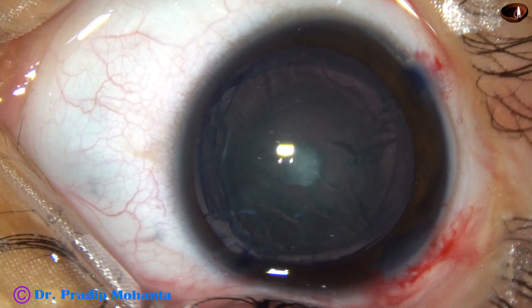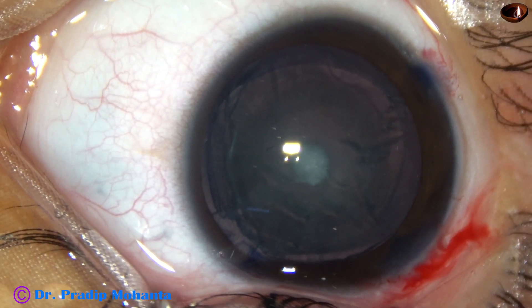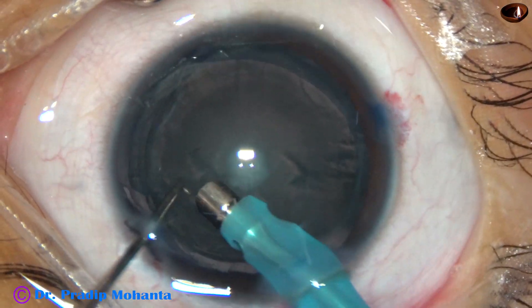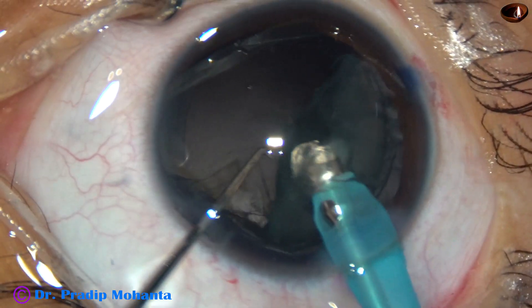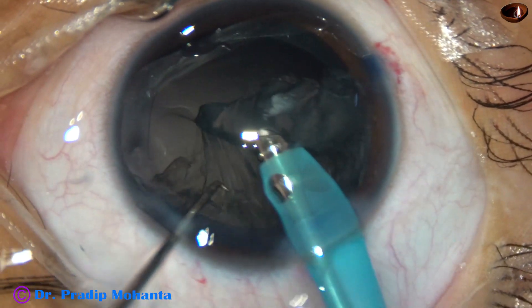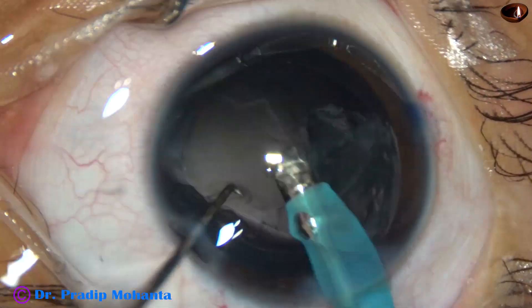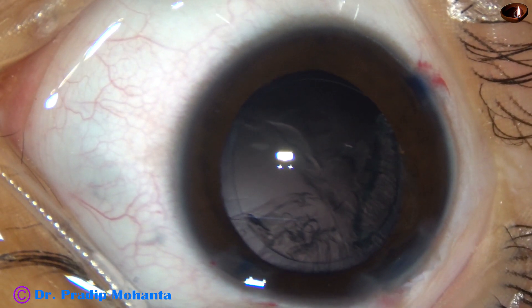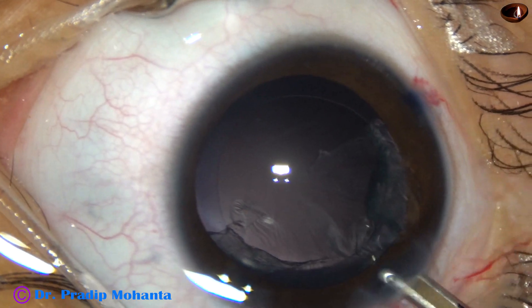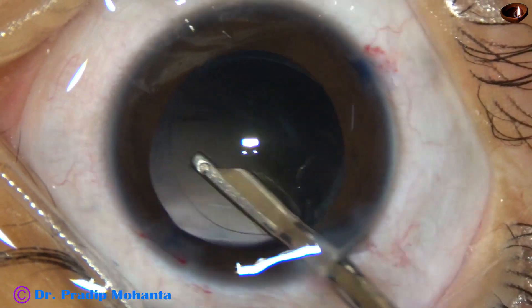Hydrodissection has been done. Now I am going to aspirate this lens mass using high vacuum and little ultrasonic energy. The vacuum is 450. This is the Catarhex 3 of Oertli, Switzerland. Whenever necessary, a very minimal ultrasonic energy is applied going to foot position 3, and thus the lens mass is managed. Most of the lens material has come out except some cortex in the superior aspect. HPMC is injected again, and now I am using a 23-gauge Simcoe to remove the rest of the cortex. It is done.